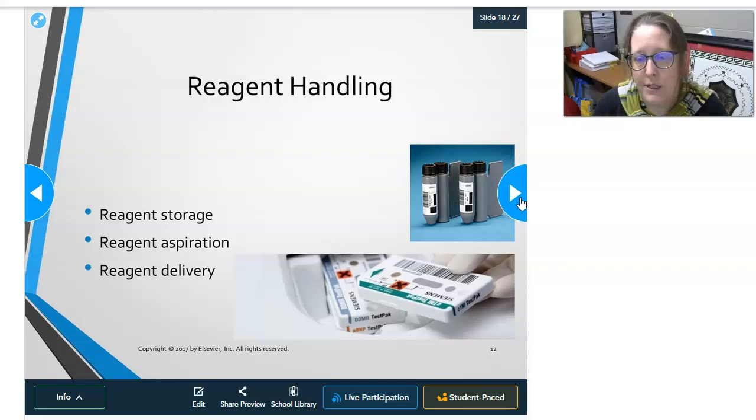It has all kinds of different formats. There are slides, there are liquids that have to be reconstituted, and it just varies from one analyzer to the next. All reagents are usually barcoded with what they are, lot number, etc. You usually want to stick with the same lot number that you've been on and not switch.